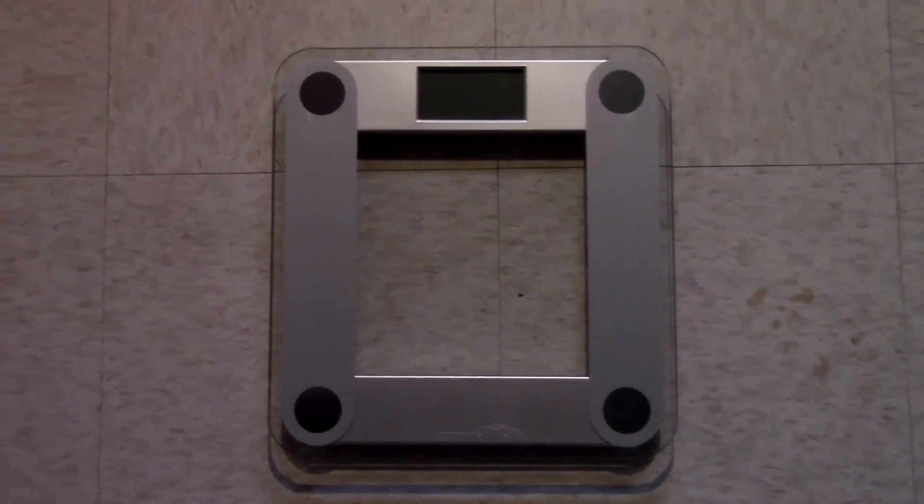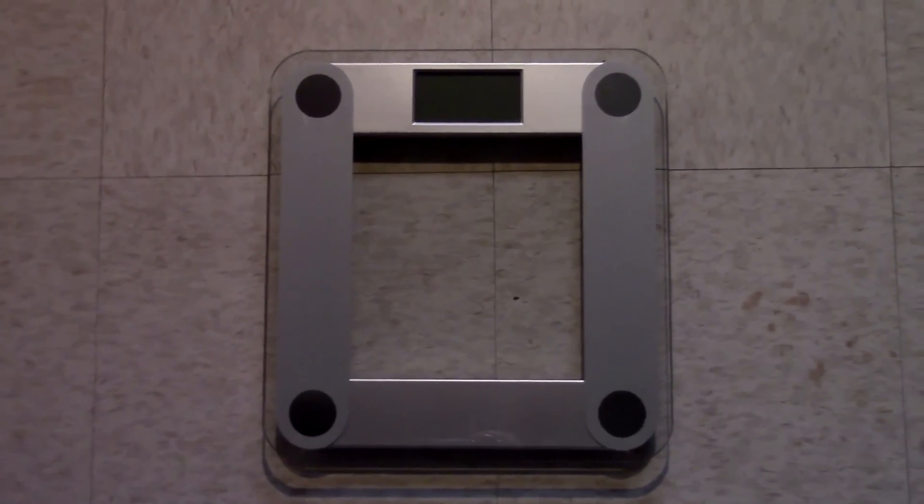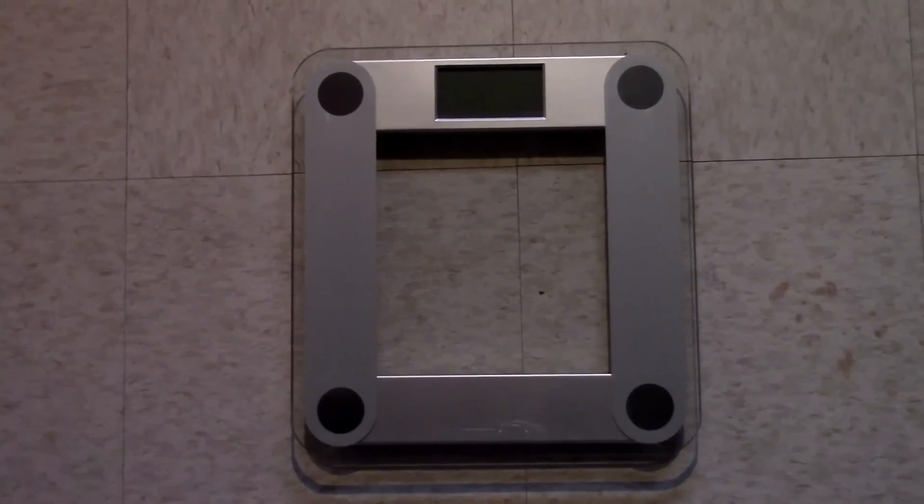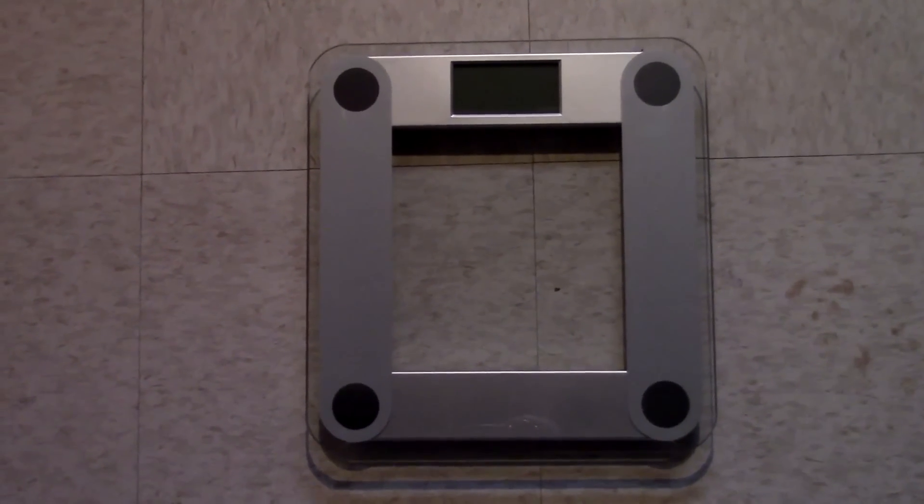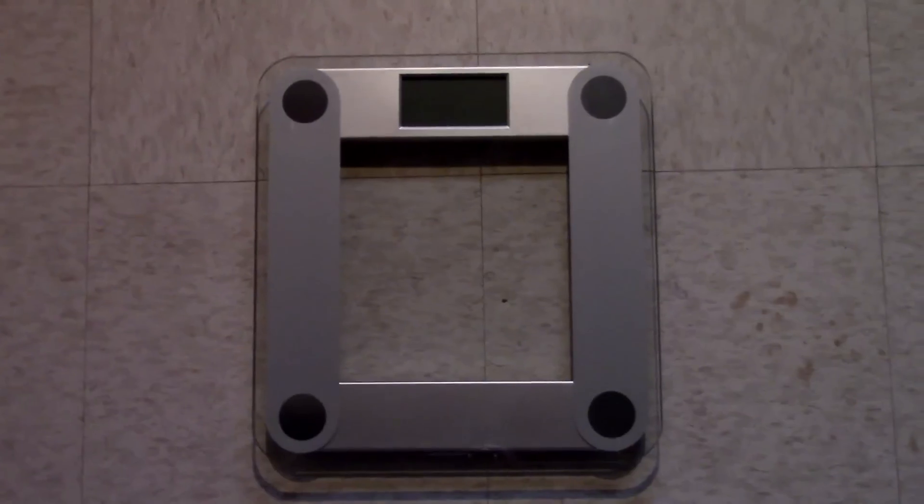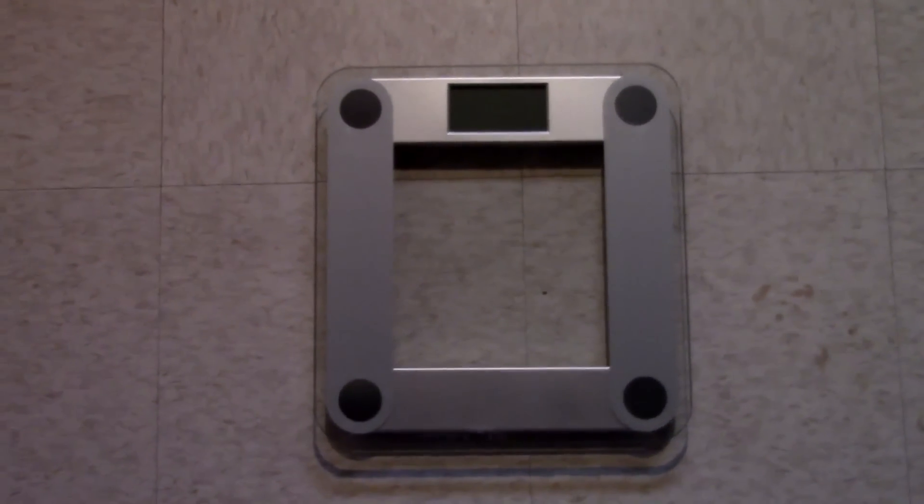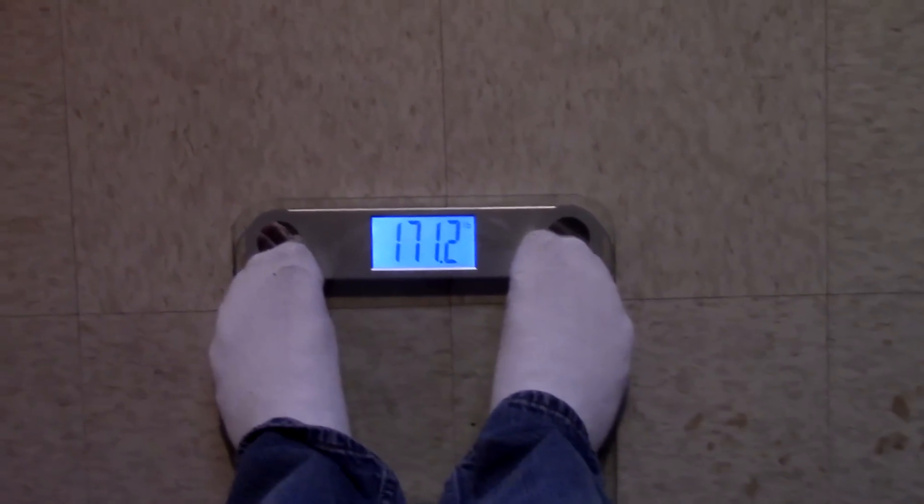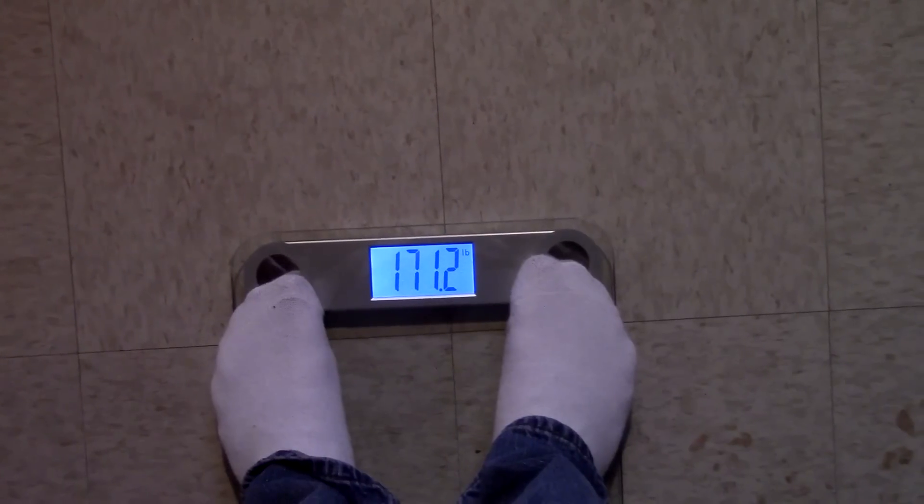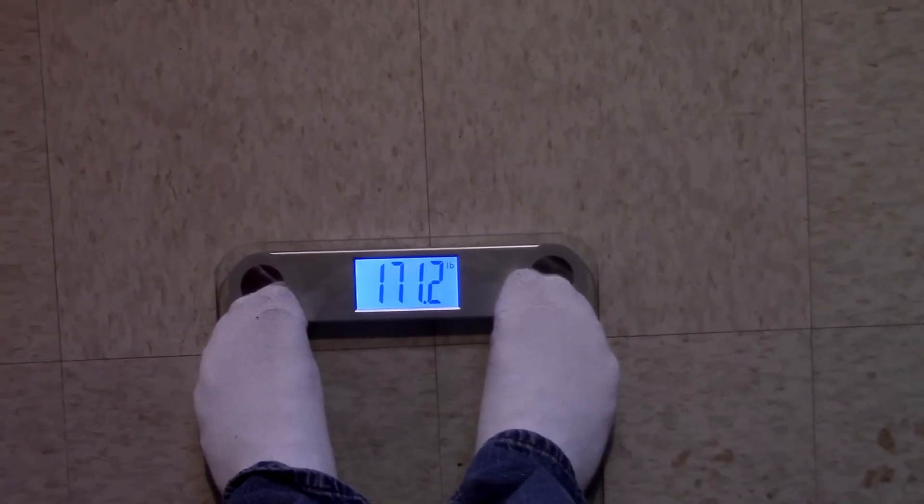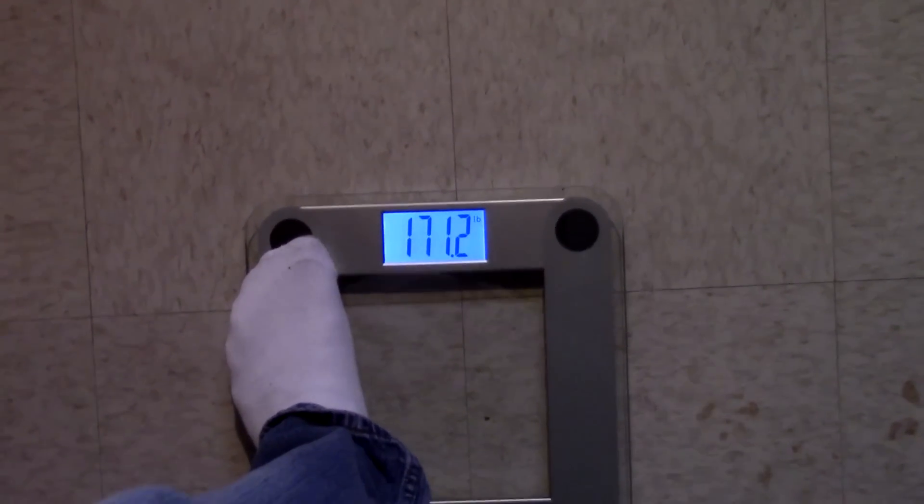So let's go ahead and step on it again to see if it repeats. And notice how I step right in the center there. 171.2. So we're good there.